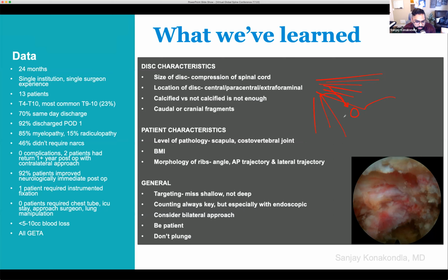I truly believe in good hands, it's still a half step, right? If we try an endoscopic procedure and we say, hey, this is too complex to take out while we're in there, we're still able to offer them any other procedure they would have gotten anyway. So, from a safety perspective, if you're operating within your limits and you talk about those expectations with the patient, live, and you make those decisions together, I think that's probably the best way to deal with that.